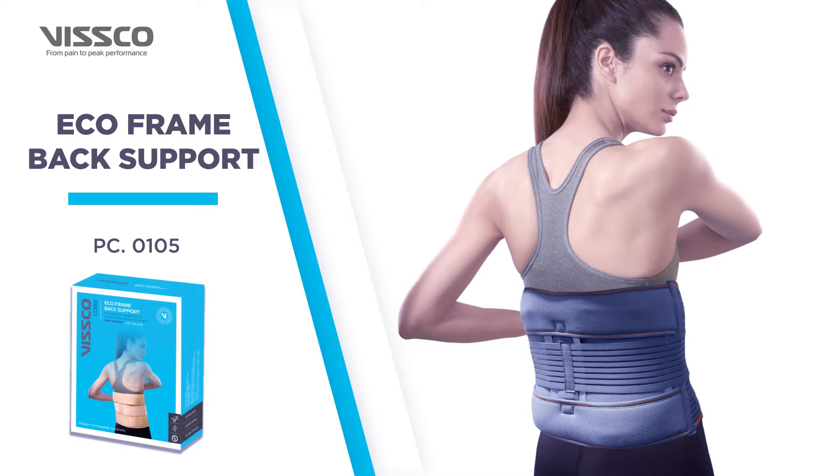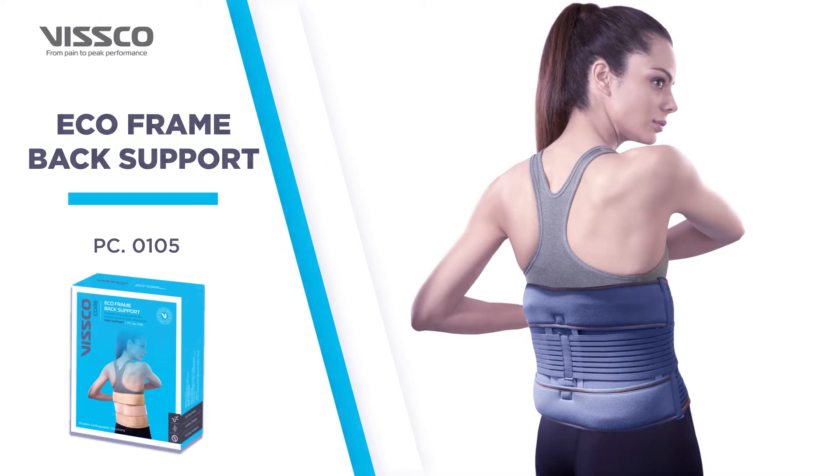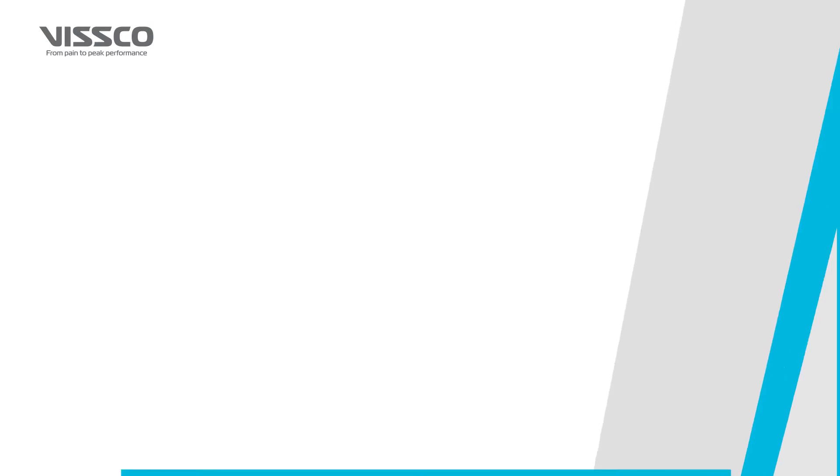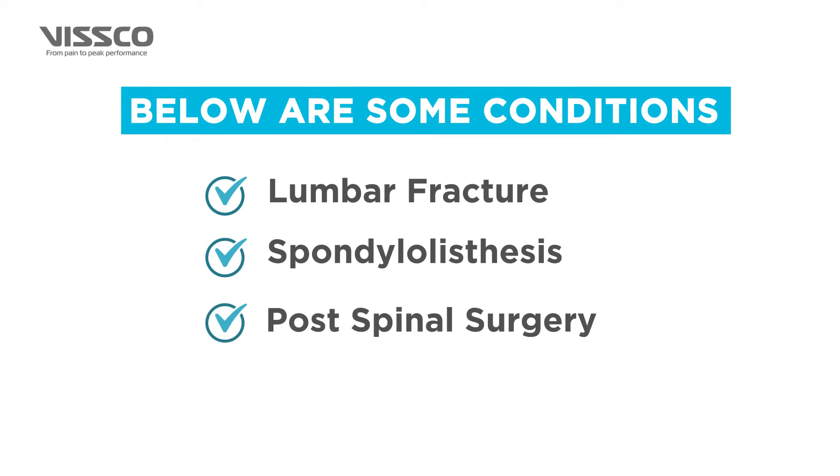The Wisco Eco-Frame Back Support locks movement and immobilizes the lumbar spine. It is used in cases of lumbar fracture, spondylolisthesis, and post-spinal surgery.